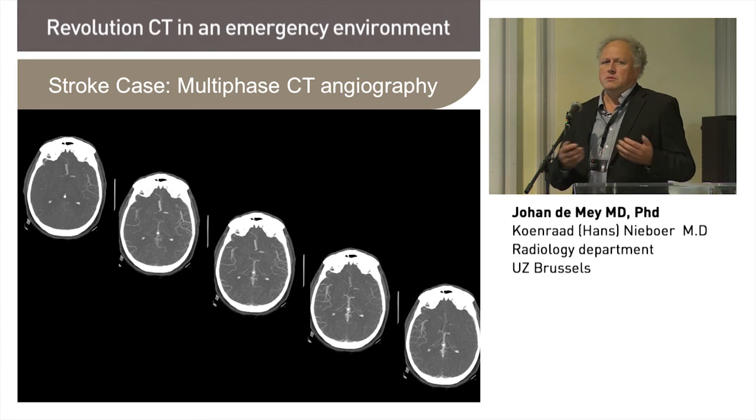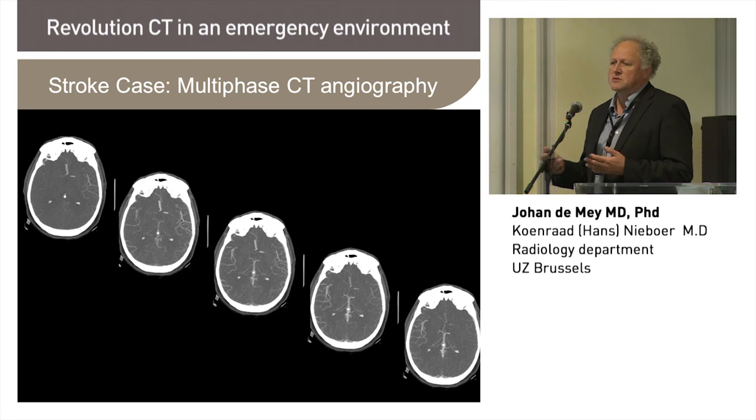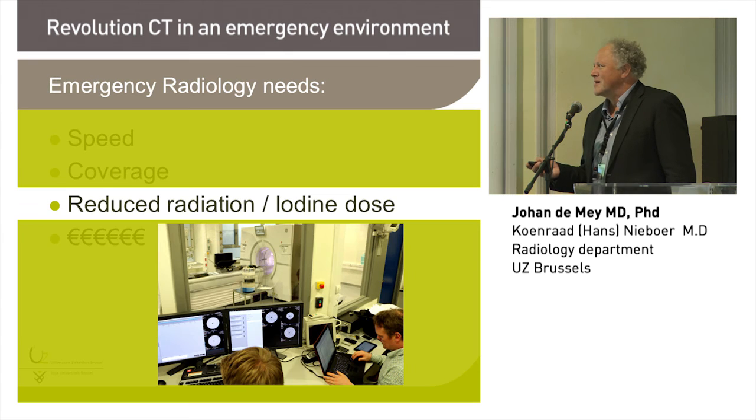And so I know a perfusion CT is better, but this is a quite easy one, and neurologists and radiologists from GARD decide based on these images to go for thrombectomy or not. And there we are also quite fast. Maybe 10 minutes after the scan, it is decided if thrombectomy is needed or not, and if the angiographyst has to come to the hospital. It's a complex machine. It gives a lot of opportunities, and sometimes we go more simple to make it workable.